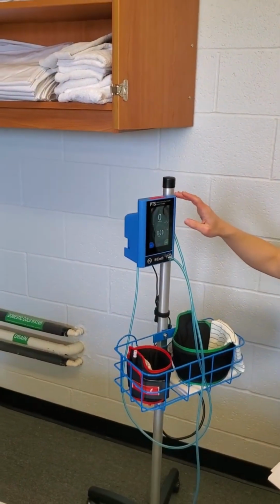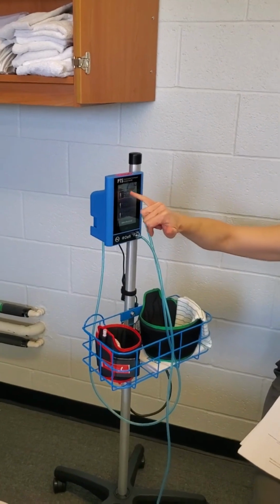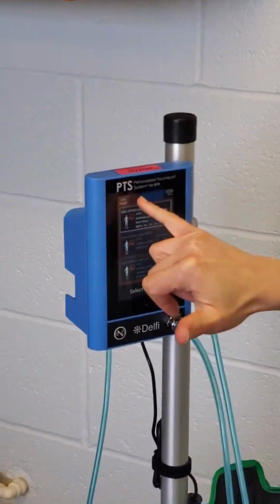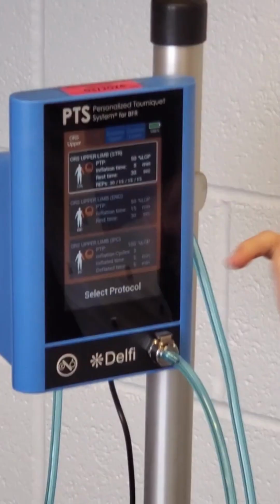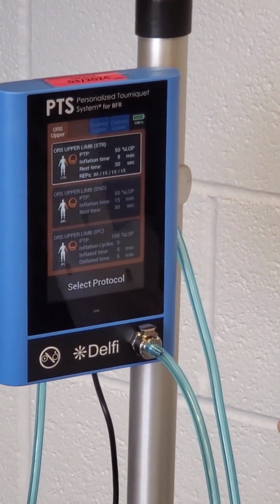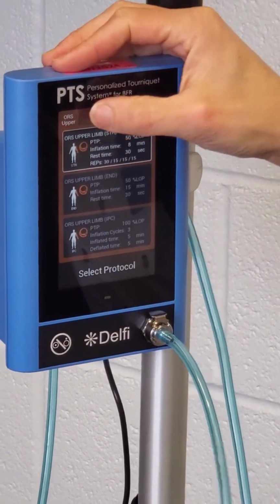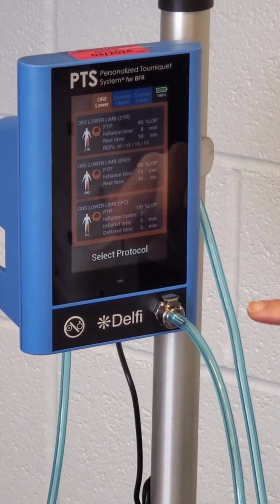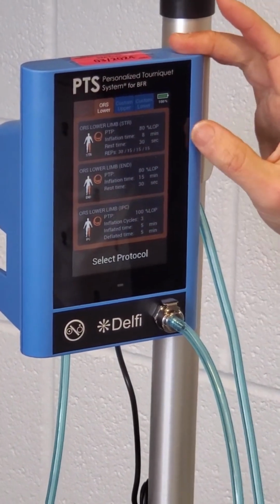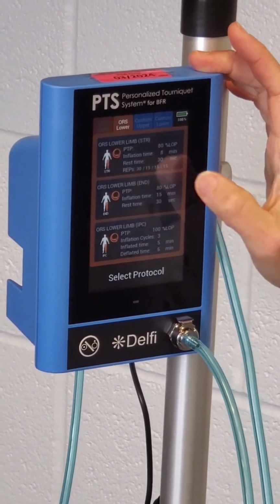There are really nice presets. If you go to this little guide, presets, this is where you can see upper, lower, or custom upper, custom lower. The nice thing is the ones built into the program are the ones you're probably going to use. So we want to do lower, so 80% limb occlusion pressure, 8 minutes, 30 seconds of rest, and there's your 30, 15, 15, 15.